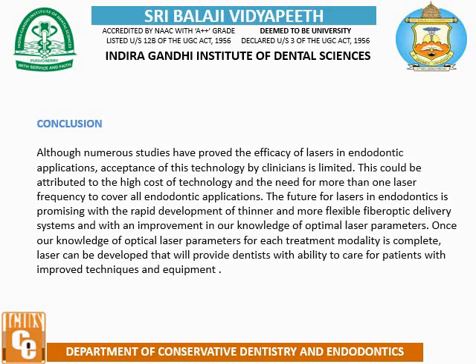Conclusion. Although numerous studies have proved the efficacy of laser in endodontic application, acceptance of this technology by clinicians is limited. This could be attributed to the high cost of technology and the need for more than one laser frequency to cover all endodontic applications.